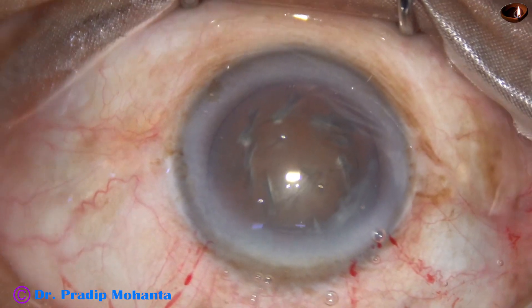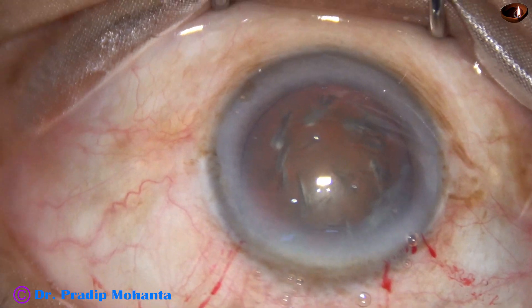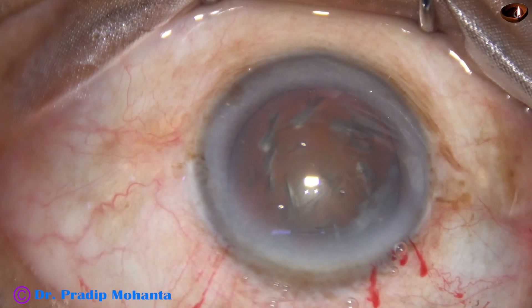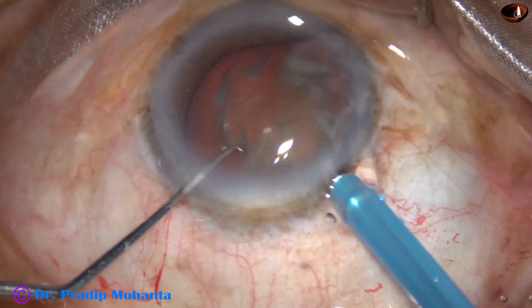This is a totally unedited recording and you are not missing anything. The microscope is Topcon OMS-90 and the phaco machine is Alcon Centurion 3.